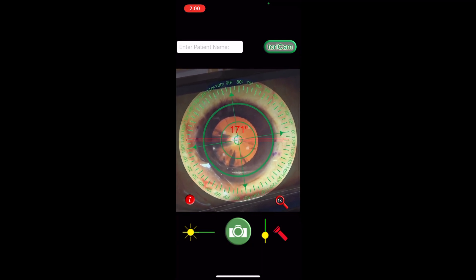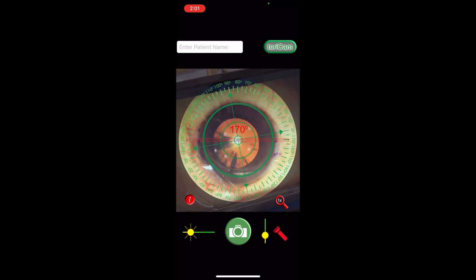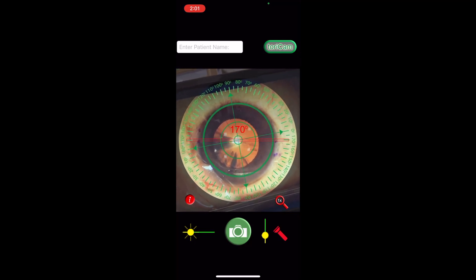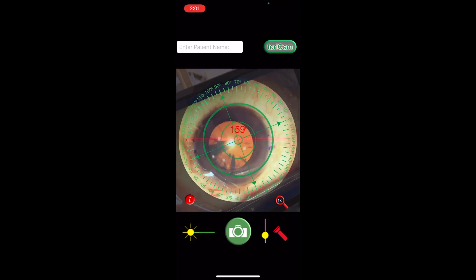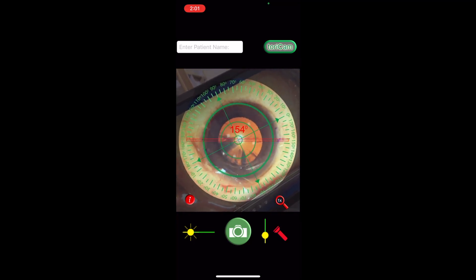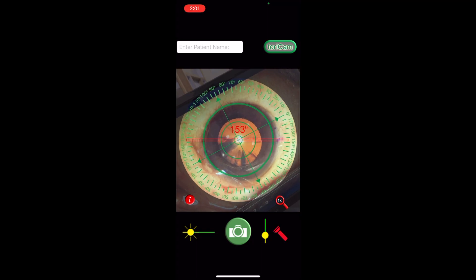The reading obtained is the cyclotorsion. Because of cyclotorsion, the app is not going to read off directly the values of the IOL placement, and in order to do this we should convert the app reading to adjust for cyclotorsion.